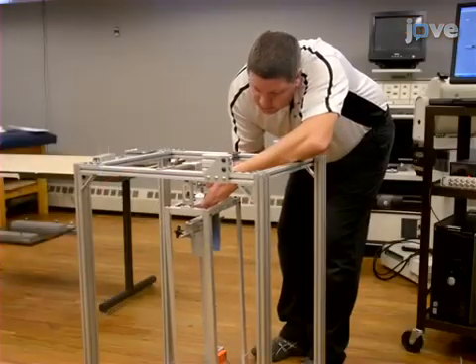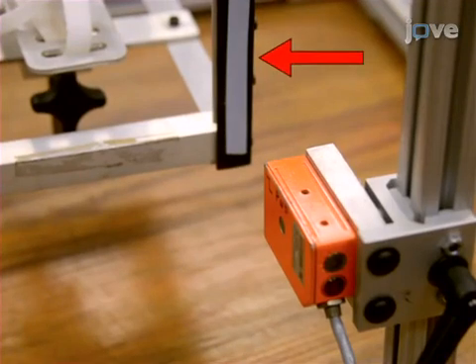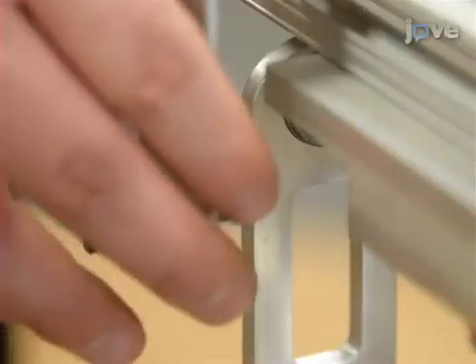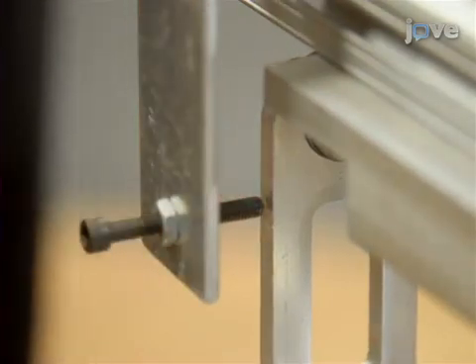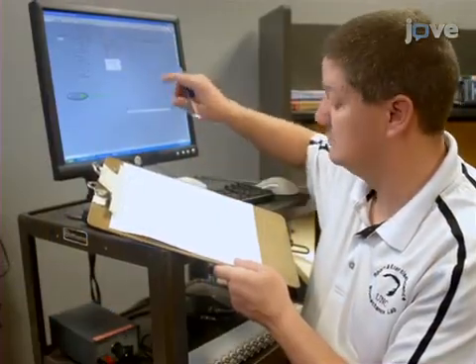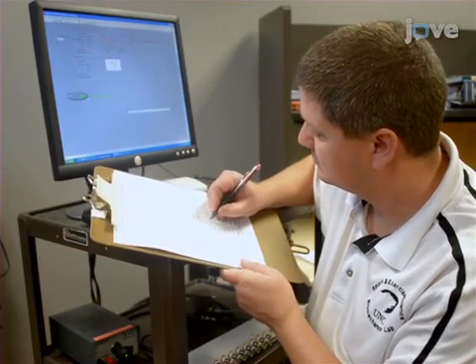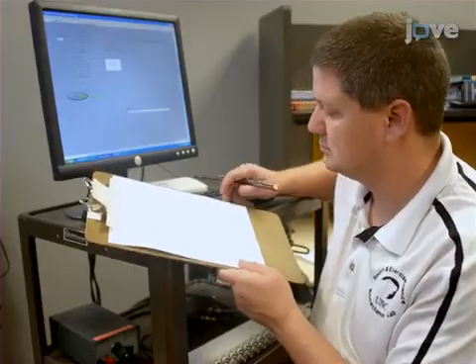Then, reposition the inner cage within the oscillation rack, making sure that the black corner with reflective tape is closest to the photocell. Secure the axis and make sure the suspending arm of the inner cage aligns with the set screw. Finally, collect 10 oscillation trials, recording only the first oscillation period of each trial. See Appendix A for an explanation of why only the first period of oscillation is recorded when the cage is empty.